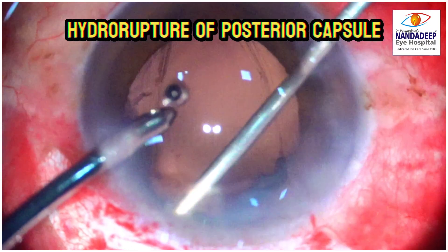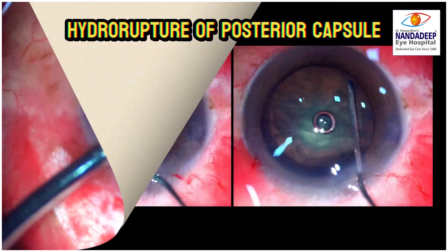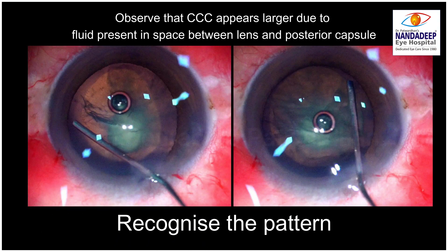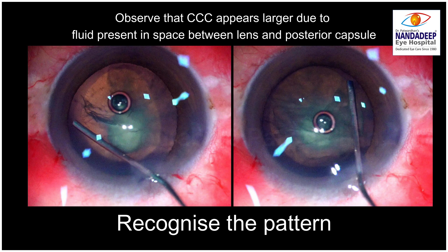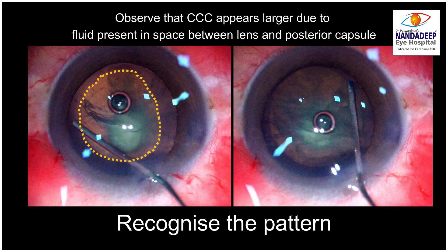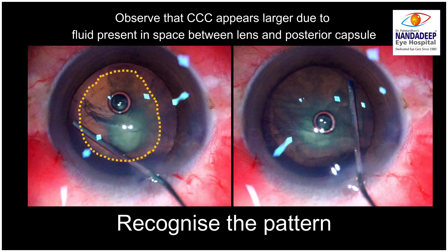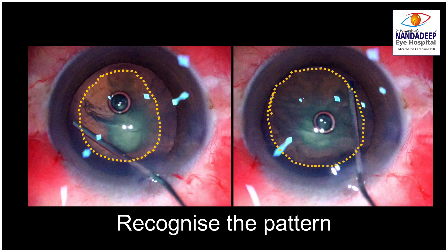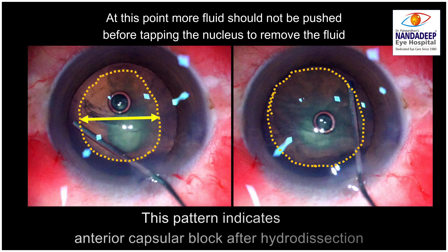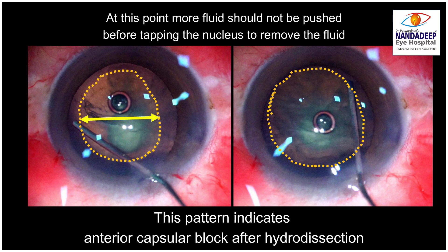Now, what is the pattern to be recognized? Observe the CCC — it appears larger on the right side after hydrodissection. That is because of the fluid present in the space between the lens and the posterior capsule. Once you recognize this pattern, you should not push more fluid at this point, but rather tap the nucleus down to remove the fluid.